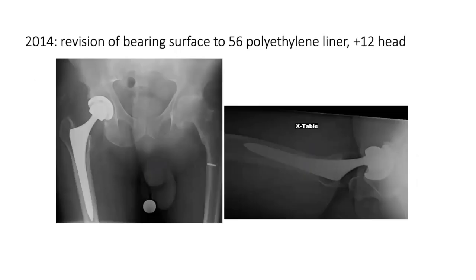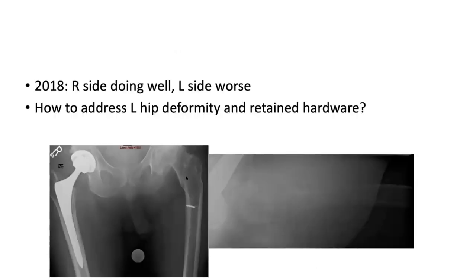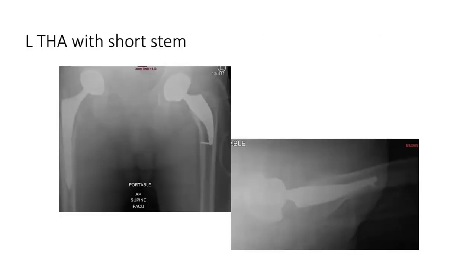Here was an example of the pre-op, right? So you see on this left side, you've got a weird deformity and some retained hardware. One way to do that, I guess you could try to dig that hardware out. You could do an osteotomy, but another way to do it is to do one of these. A short stem, exactly, to not have to deal with any of it. It looks like they had good metaphyseal bone. You can get a good fit there. Why not use a short stem? Right. So then the question becomes, how is this going to do in 10, 15, 20 years? And I guess that remains to be seen.